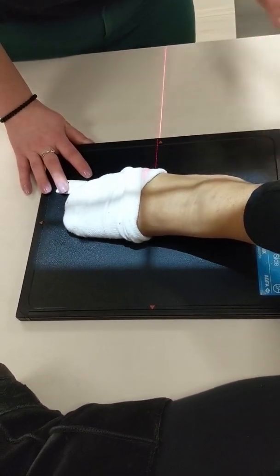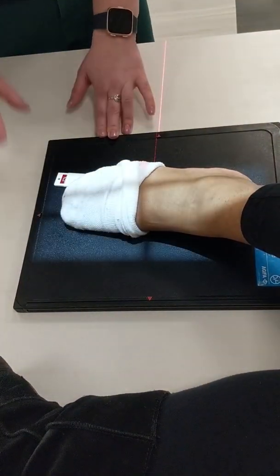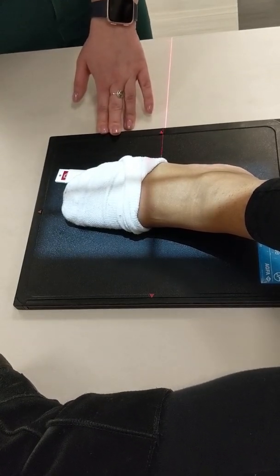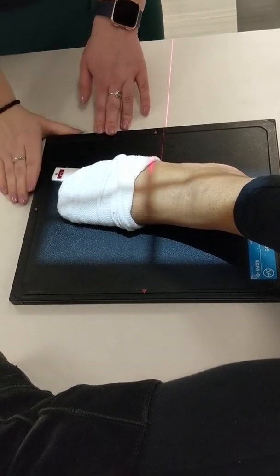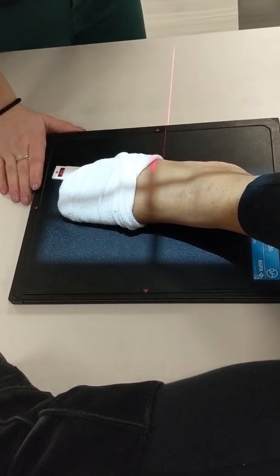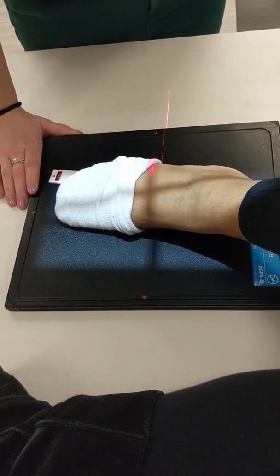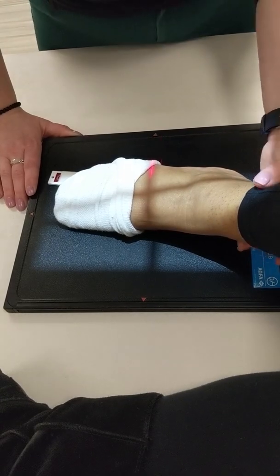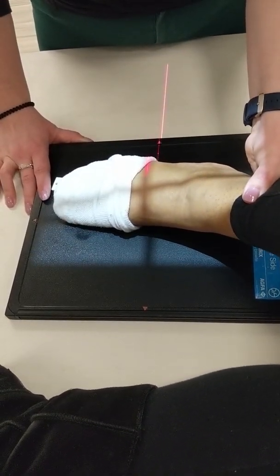Okay, still not happy with that. So just through the movements, we've come out of centering just a little bit. So I changed the CR to center on my anatomy better. Now I'm gonna help her again, just lift straight up, and I'm gonna line up my tube and Bucky, or my tube and my IR again.